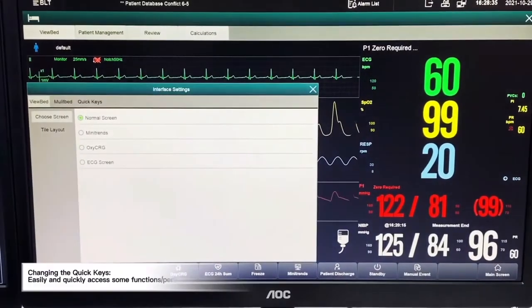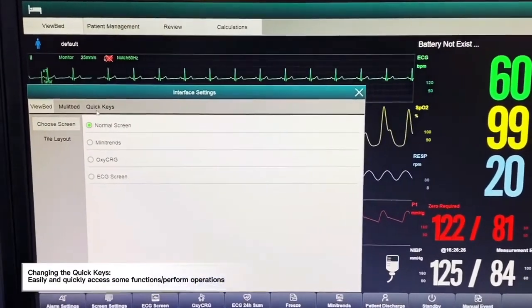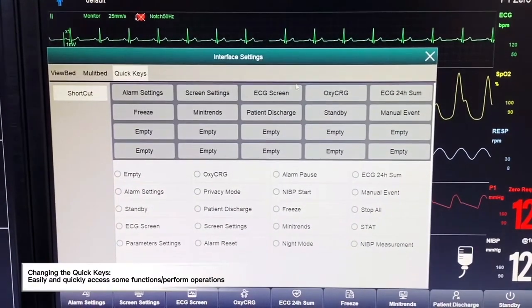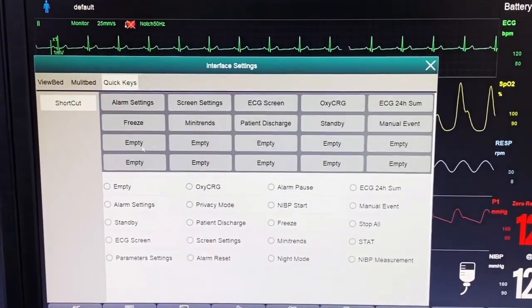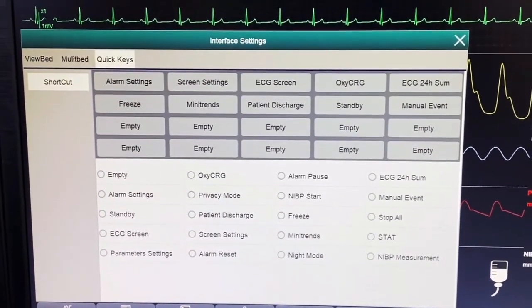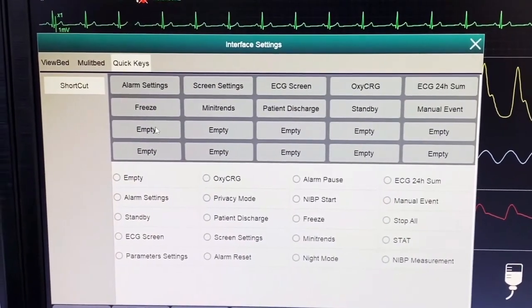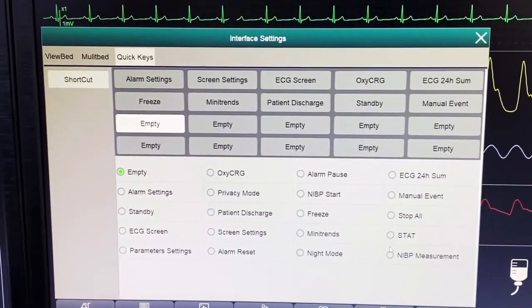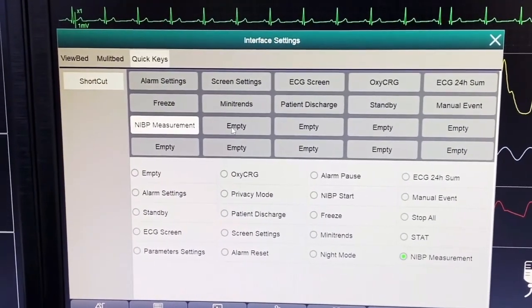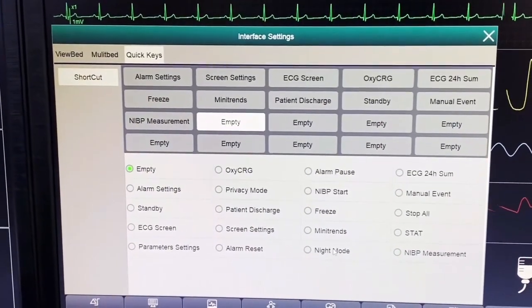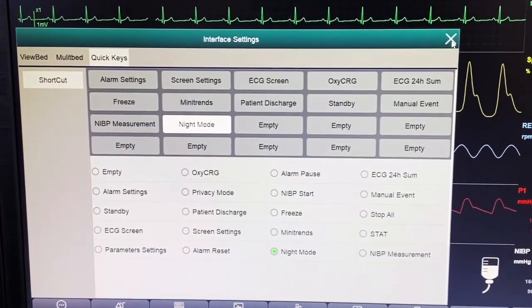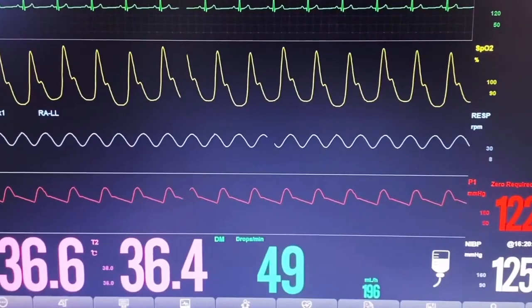We can customize the quick keys. When we click onto the quick keys, we can see several default settings. If we want to choose some quick keys to put onto the manual bar, we can choose the location, then select for example NIBP measurement. We can also choose night mode — I can put it here — and after closing, we will be able to see NIBP measurement and night mode in the quick keys bar.